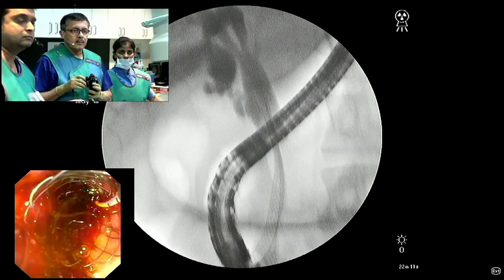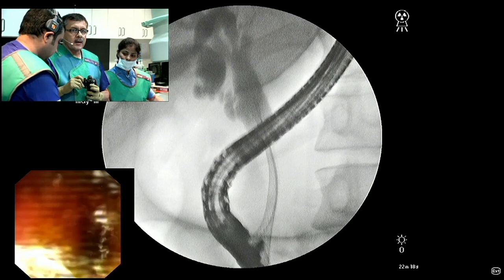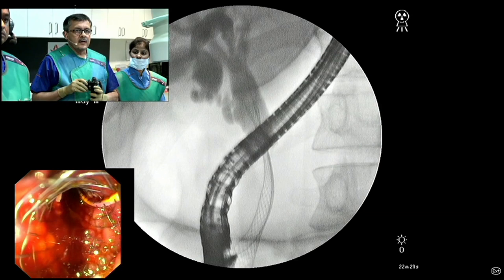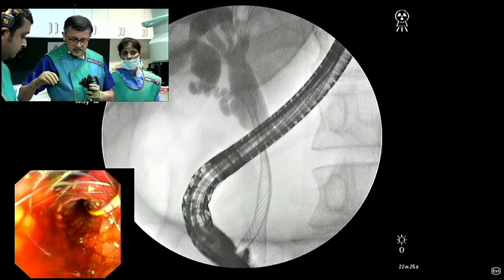Normally, this stent, the Evolution stent, has a very good axial strength, and it should open up like a flower. And the part of the stent which is inside the dilated portion of the bile duct, there's a sufficient amount of stent there, so it should have opened up like a flower. It looks like it's opening up now. Quickly, take a hurricane balloon and dilate that area a bit. As you see here, Rob, the stent is at least 2-3 centimeters below the hilum, so that area is sufficient. So it's a beautiful cannulation and stent deployment, Amit.